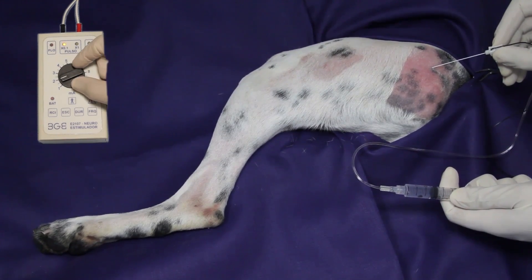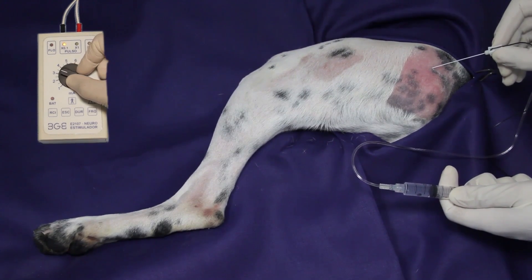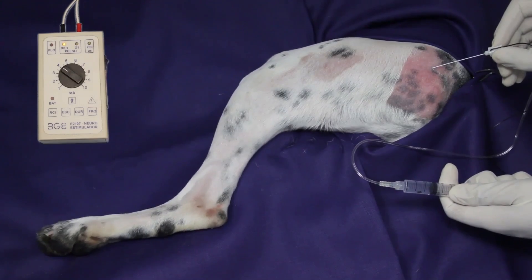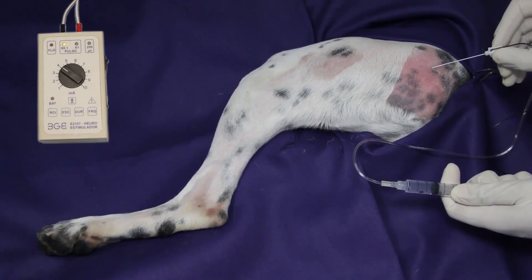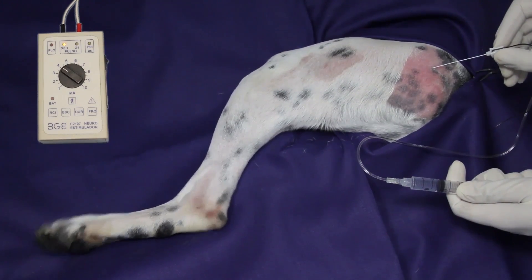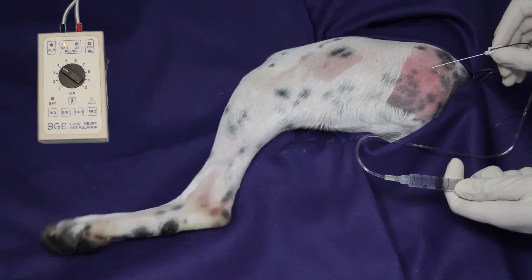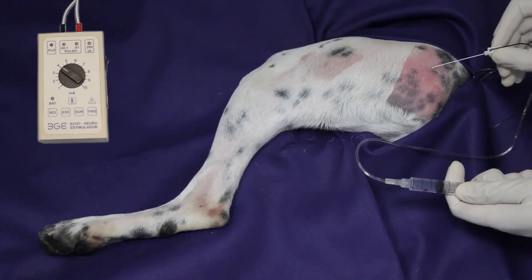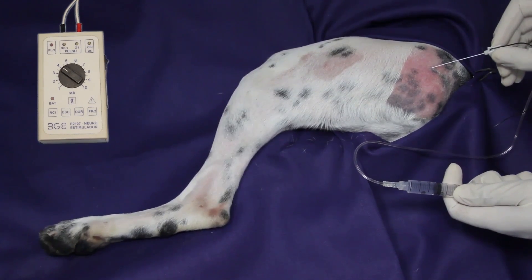Contractions should be continuously observed; otherwise the needle is repositioned. Persistence of muscle contractions at 0.2 mA may indicate the needle has been inserted into the nerve.